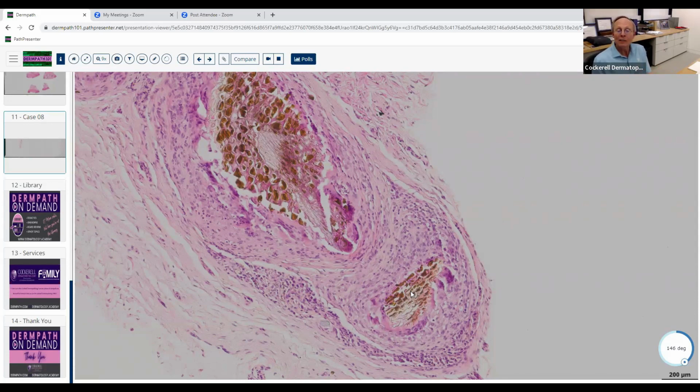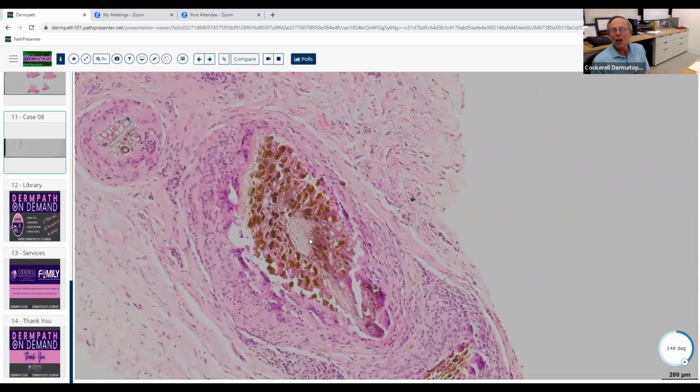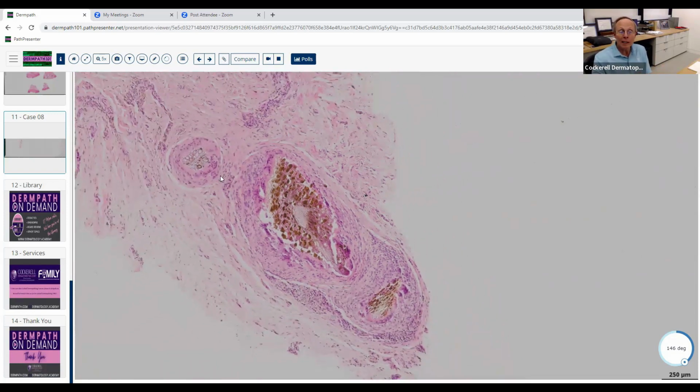But if it's just a routine few hyphal elements seen associated with the splinter, that's just considered coincidental fungal hyphal elements associated with the splinter, and the patient doesn't actually have any disease associated with it. So that's probably the most important thing there. But just recognize this is a splinter, it's a foreign body. They could ask you on the board something like this.